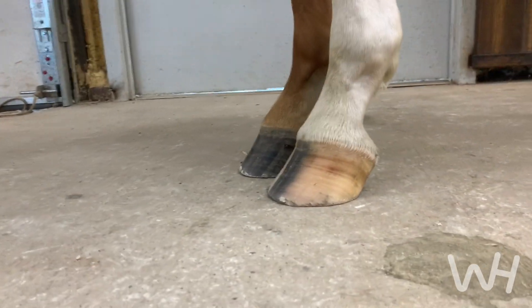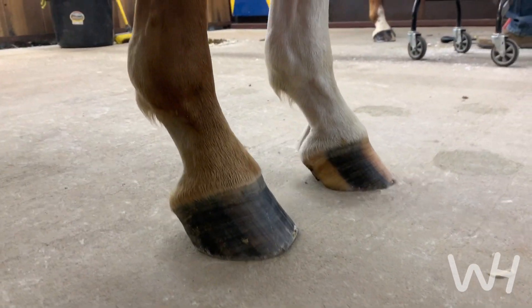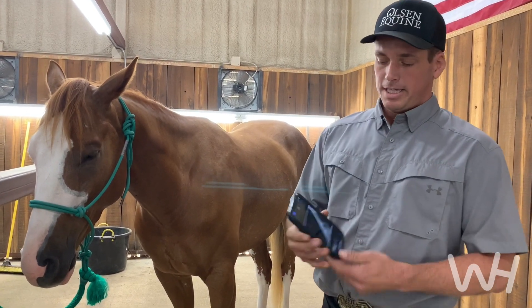It's one thing that I highly recommend for horse owners: get x-rays taken because they can easily send them to your farrier, pop up on your phone, know exactly what you're working with, and see exactly what's going on inside.